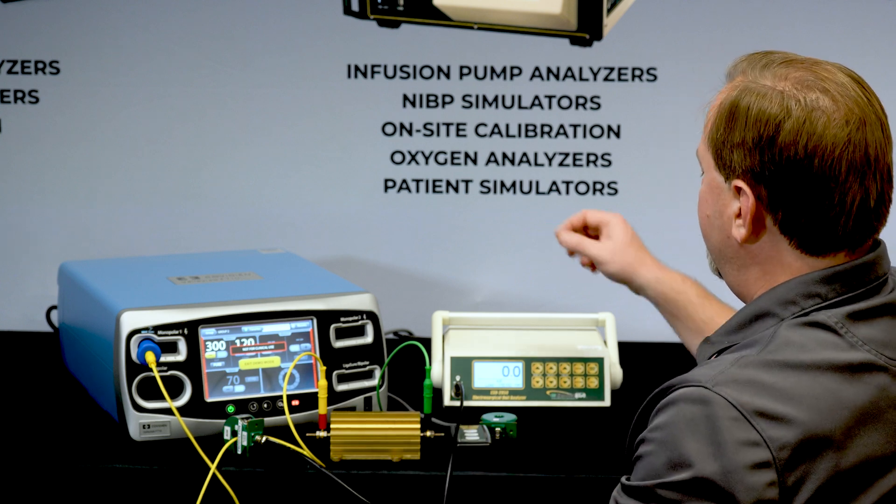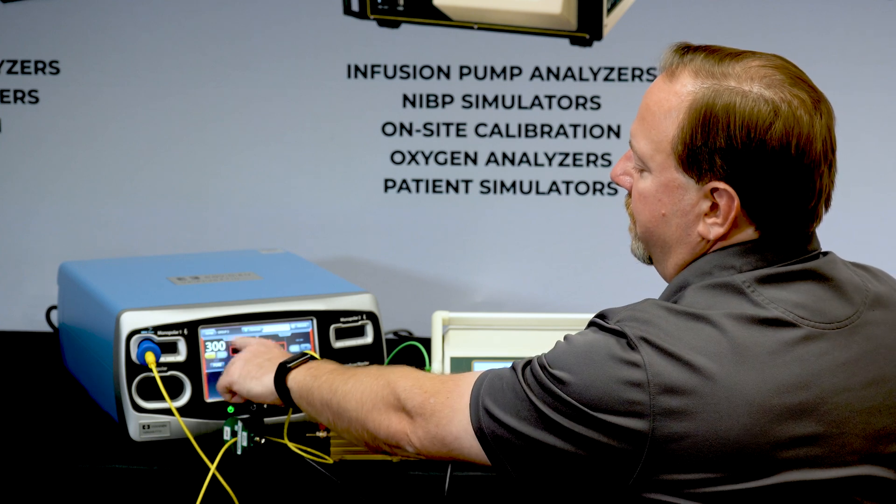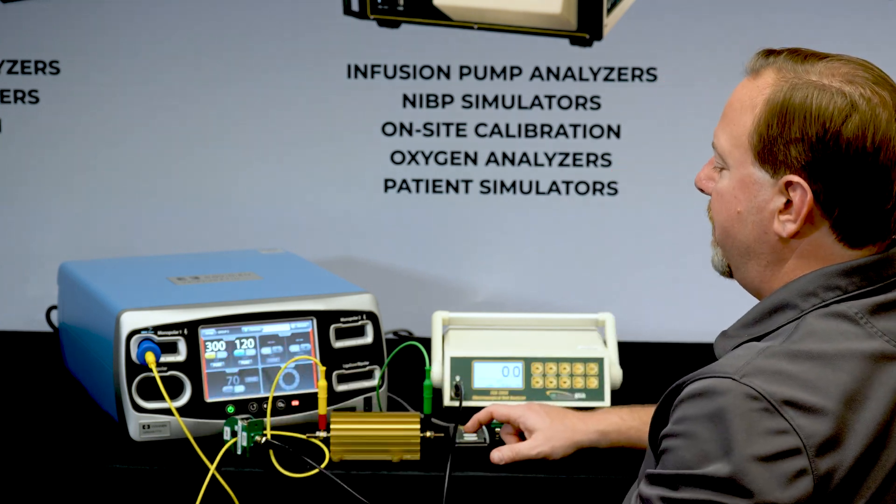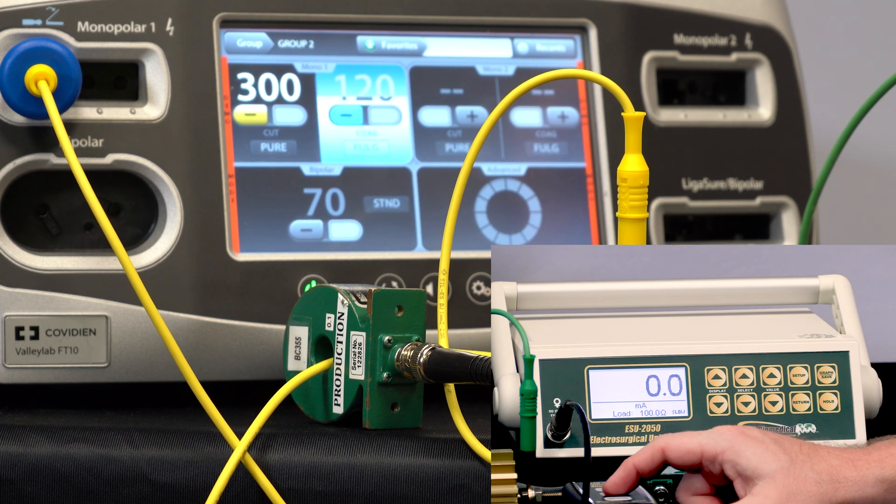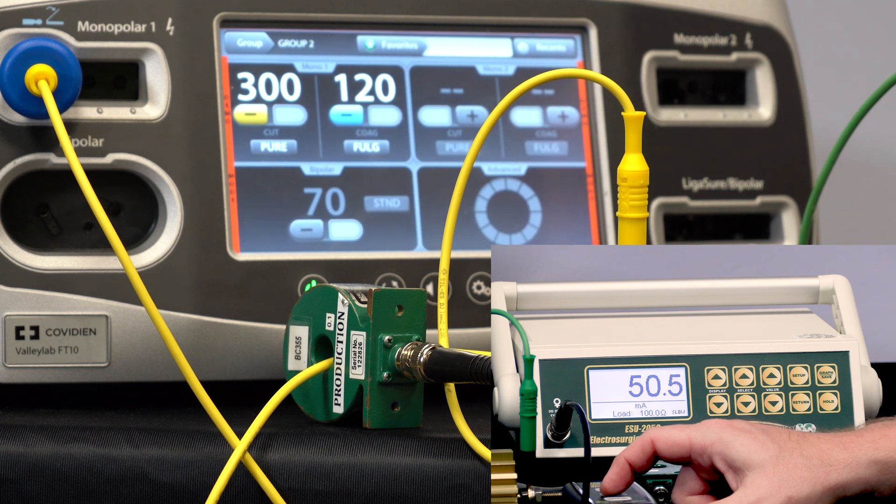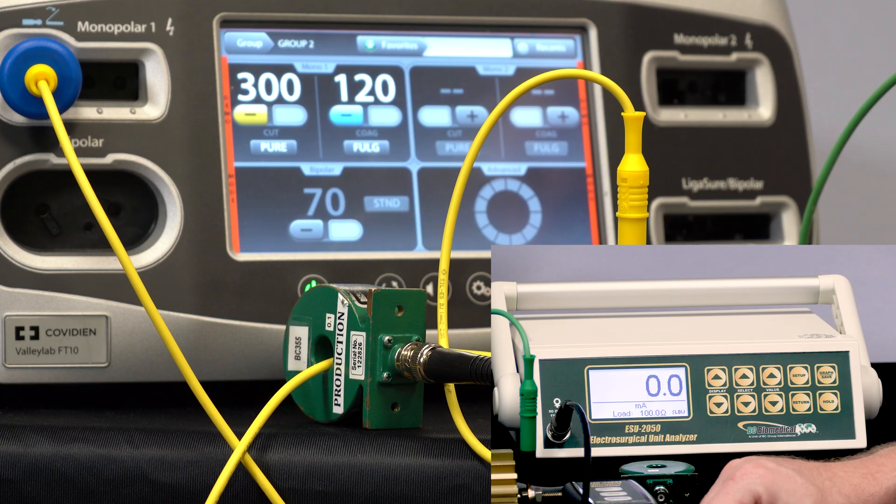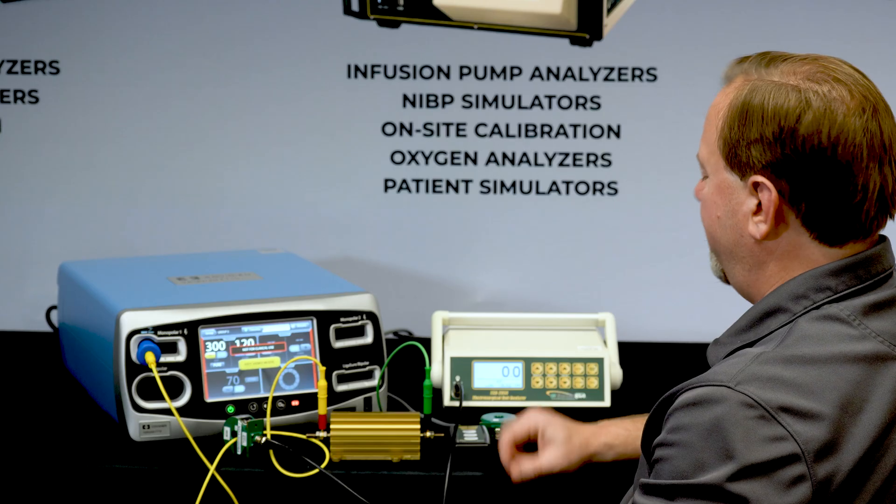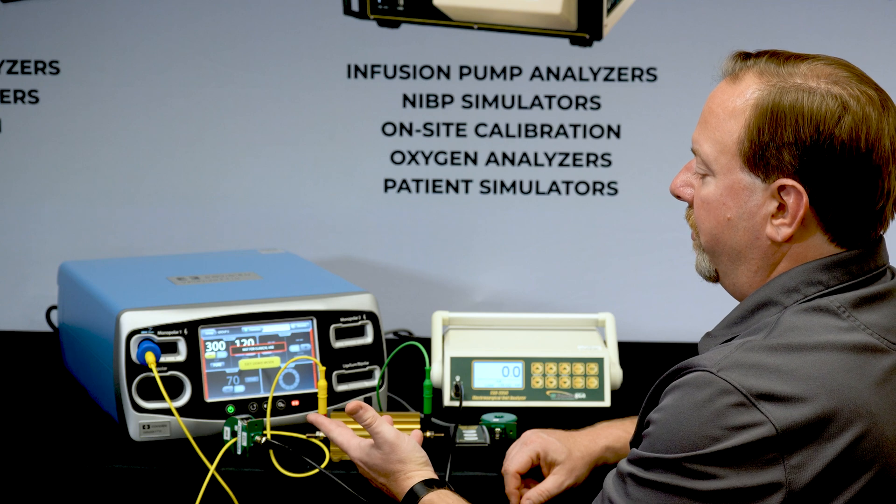And so we can trigger the generator typically with the maximum power setting for each mode. So for cut that's going to be 300 watts and coag that's going to be 120 watts. So then we can get our measurement and compare that to the limit and make sure that this device is safe. Typically it's 100 milliamps. So that's the monopolar one port test.